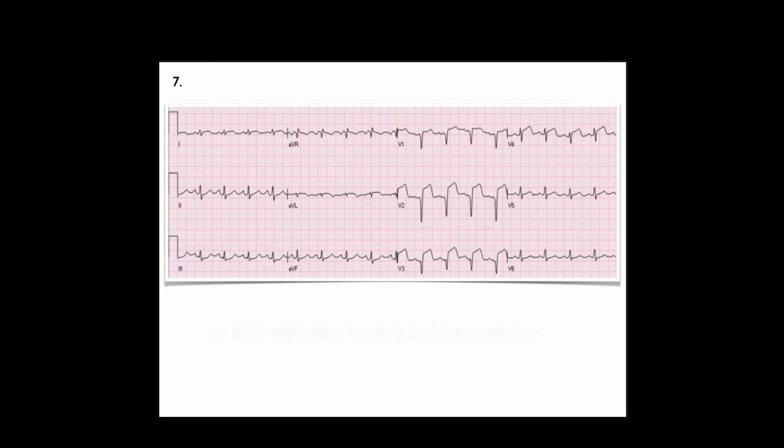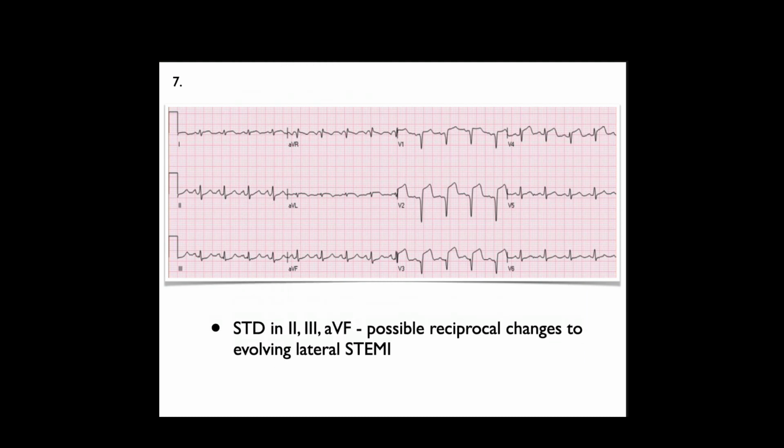There's also one in aVL, it's hard to see. It is hard to see. The T waves are flattening. So most likely here is the possible reciprocal changes to an evolving lateral STEMI, is your best guess here, which is what you said. I totally agree.